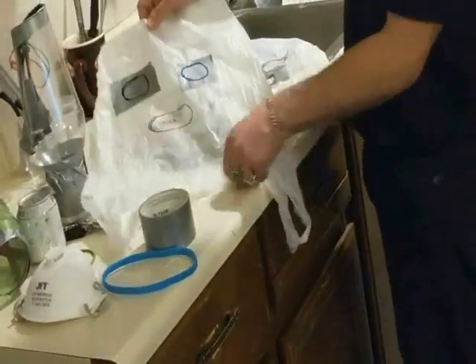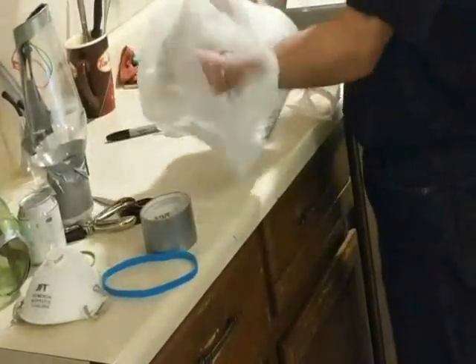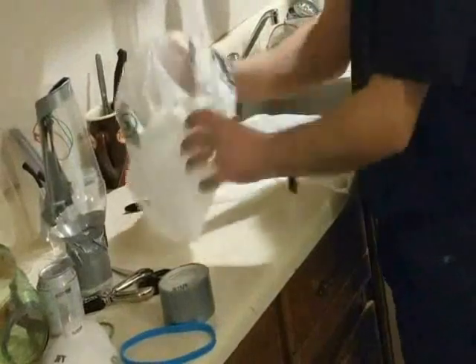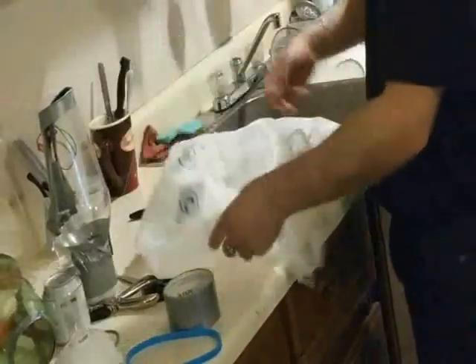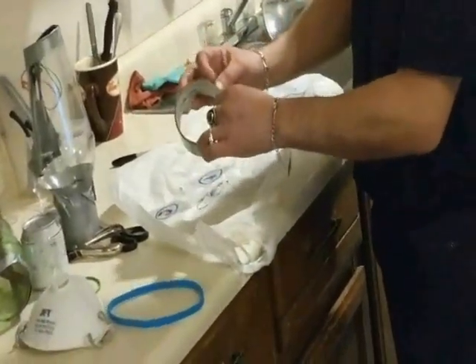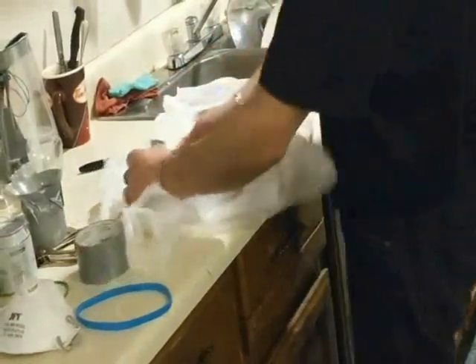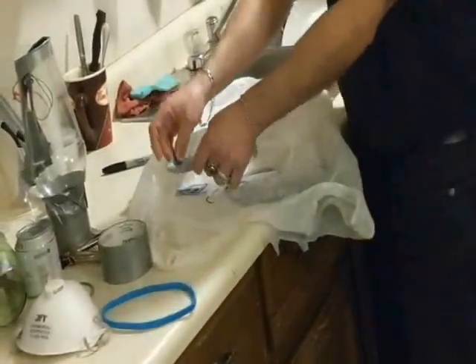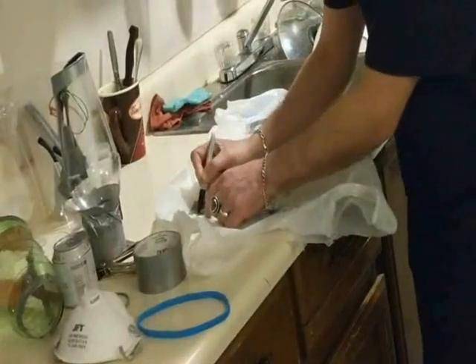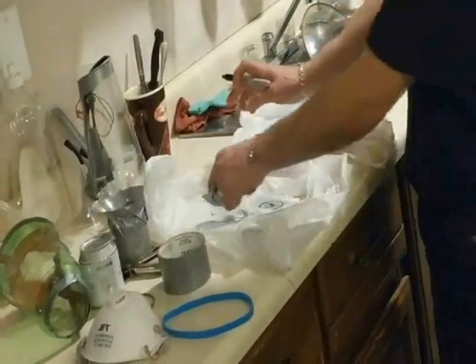And once you put one there, also the duct tape there, then turn it inside out, and you'll be repeating the same process on the inside. You can see where the duct tape is right here. Put another piece of duct tape right there, and remember to line it up nicely, as bang on as possible. Now you can do your eyeball again, your eyes, and you'll do it on the inside again for your mouth and your eye.